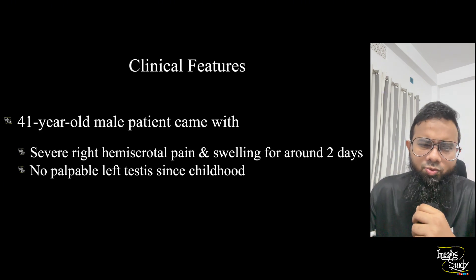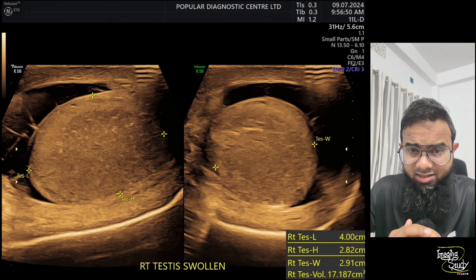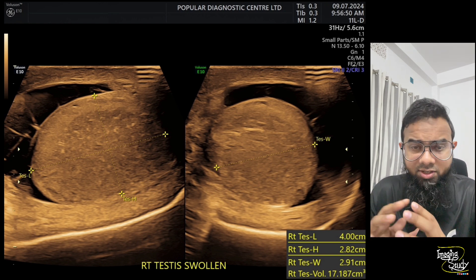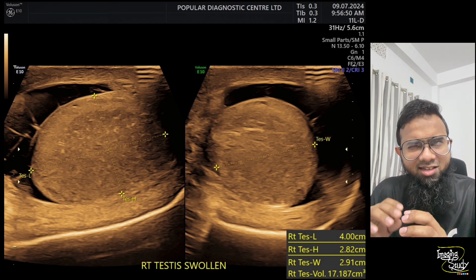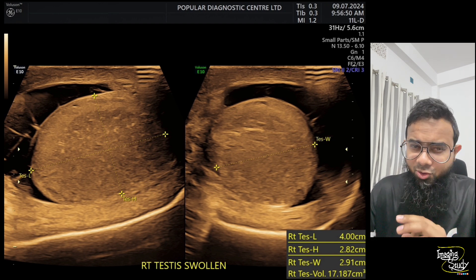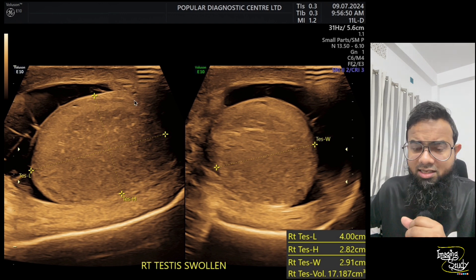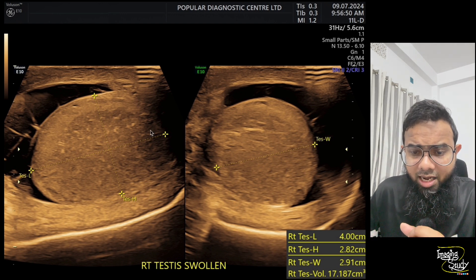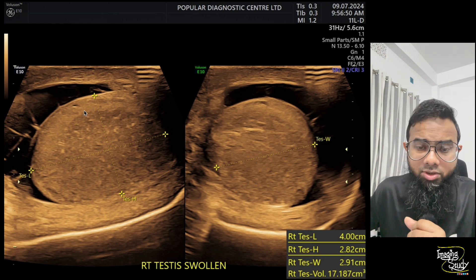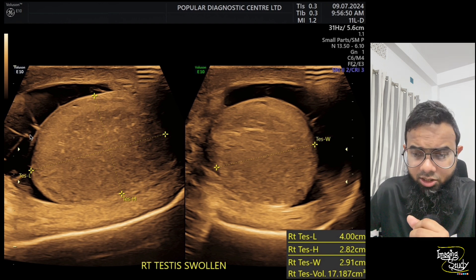Let's see what we have on ultrasound. Here you can see the ultrasound image of the right testes. It is quite swollen. Normally it's all about comparison between the right and left testes, but the patient says he couldn't palpate the left testes, so it's quite difficult to compare. The testes is quite heterogeneous; you can see a hypoechoic area here, and there is also some hydrocele around it with some tiny septations.